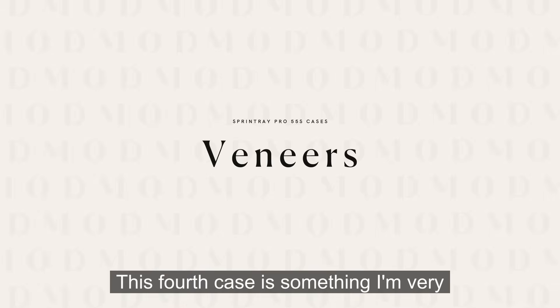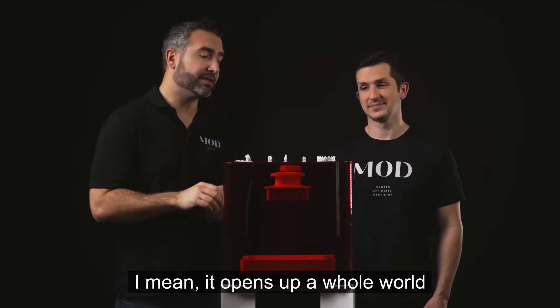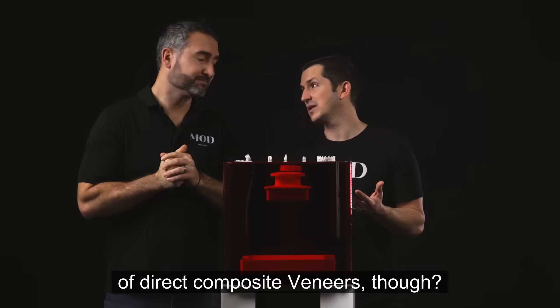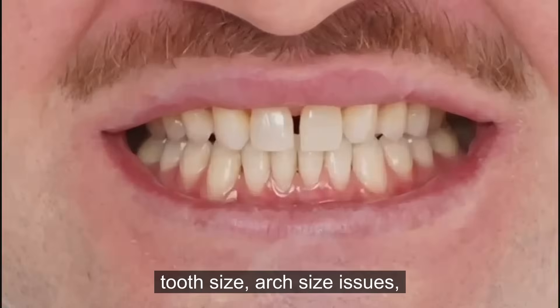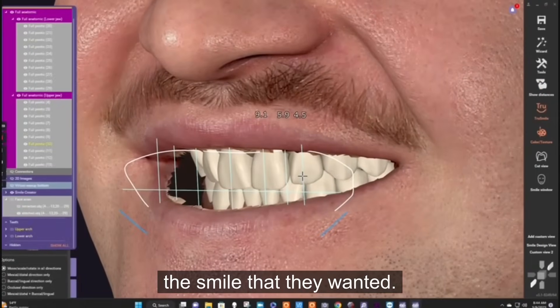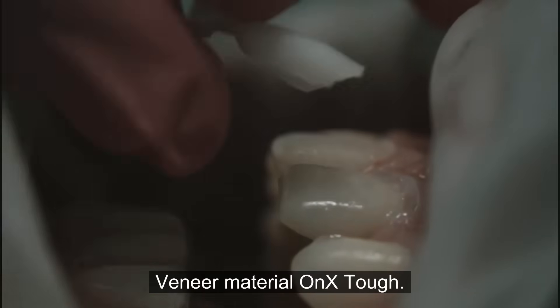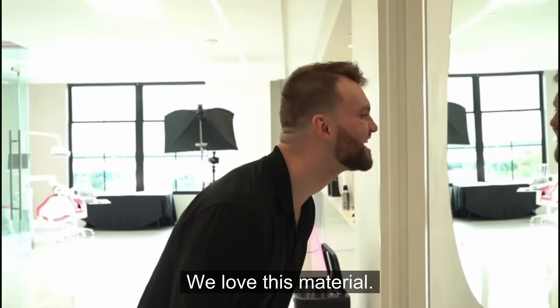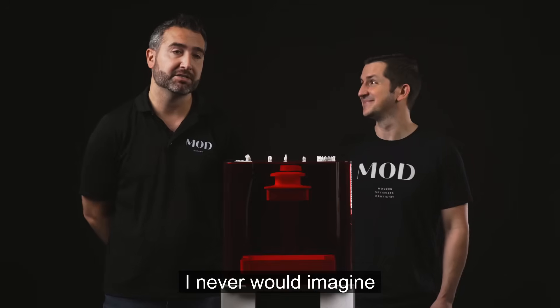This fourth case is something I'm very passionate about: ultra conservative, very thin, lifelike veneers that are 3D printed. It opens up a whole world of possibilities when you can print 20 veneers in 20 minutes. This patient presented with a Bolton discrepancy — tooth size and arch size issues. We scanned them in, did a very minimum prep, and designed the smile with the patient right there with us. We printed these out of Onyx Tough in Hollywood bleach, which polishes to a very high shine. 20 veneers were done in a single appointment — I never would have imagined this was even achievable.